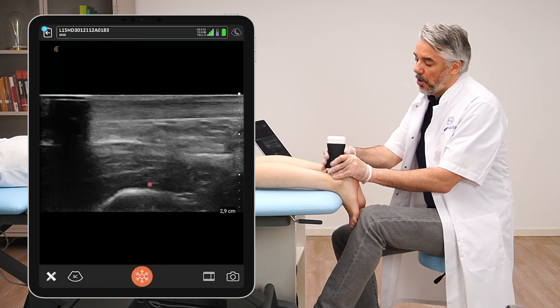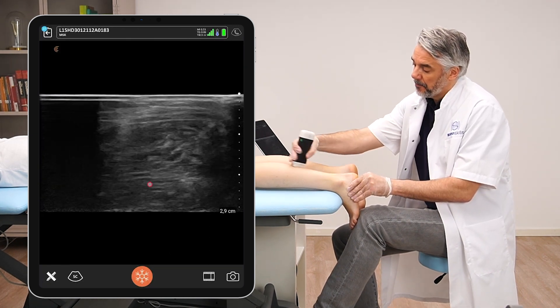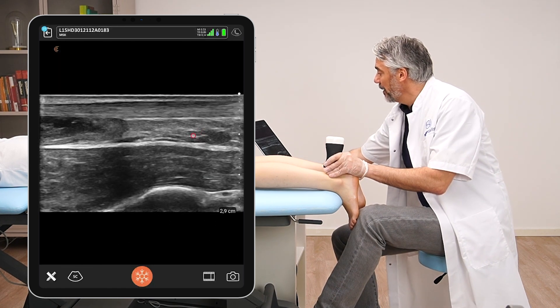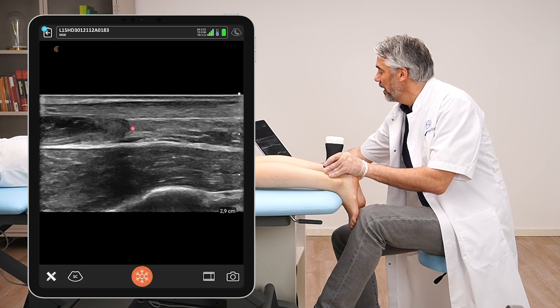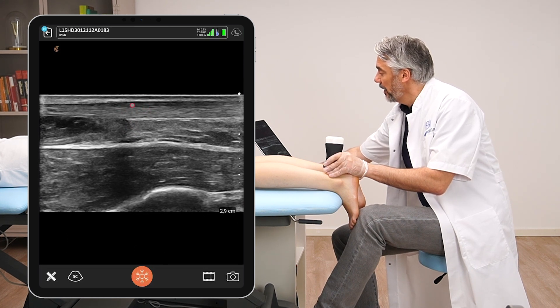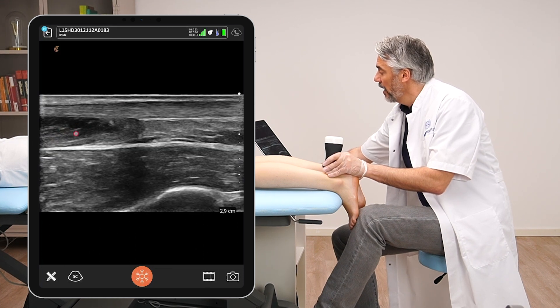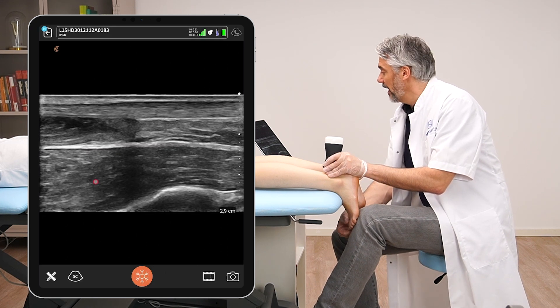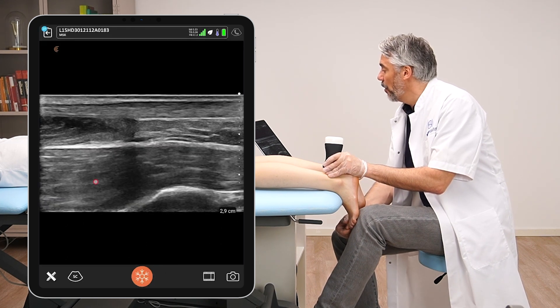Sliding more towards proximal, we can see that the Kager's fat pad becomes smaller and ends right here. The Achilles tendon is becoming thinner at that point, and this is also the zone where we can see this dark muscle — the soleus muscle — inserting into the Achilles tendon, with the large flexor hallucis muscle visible underneath.